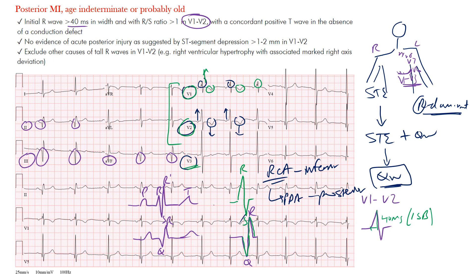Why is the T wave discordant? There's something called memory T waves. Memory T waves are inverted T waves that tend to stick around — they may actually stick around for years and maybe never go away. They may eventually flatten out and revert back to normal, but that's something you can see in these patients.